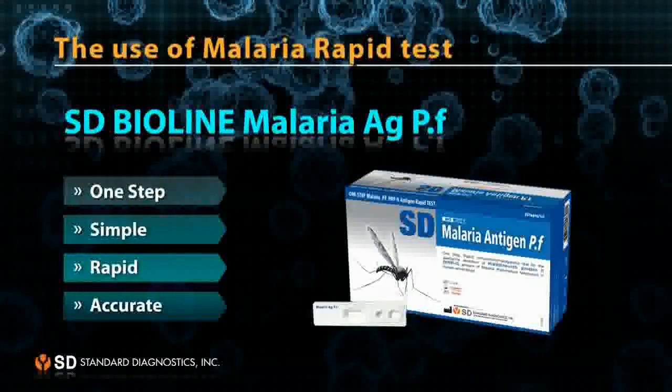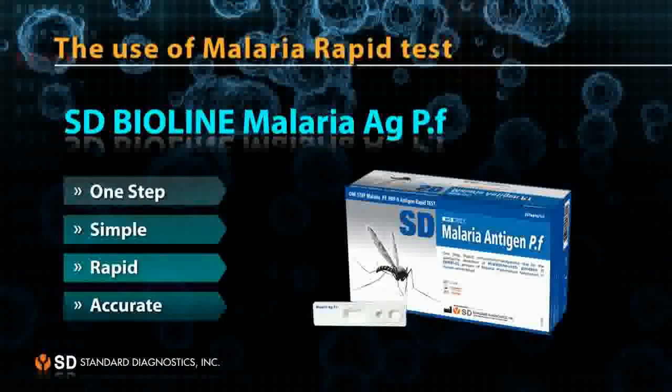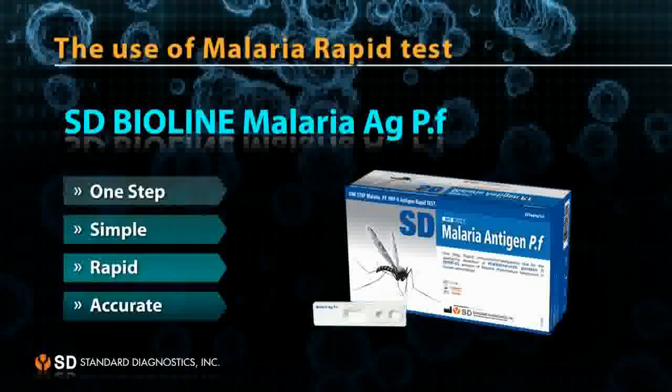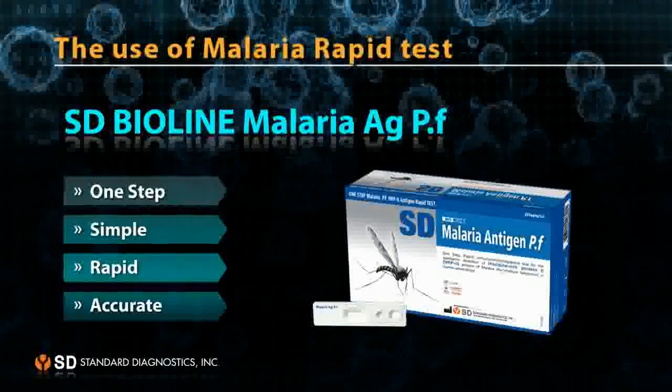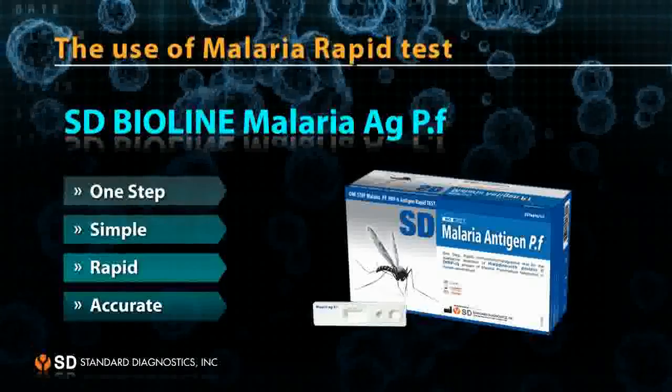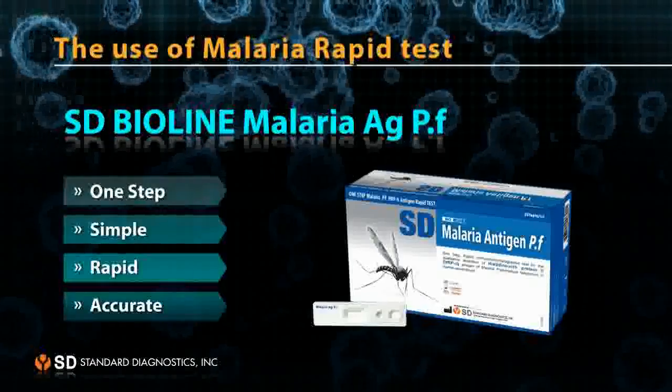Malaria Rapid Diagnostic Tests, RDTs, assist in the diagnosis of malaria by detecting evidence of malaria parasites in human blood. Malaria Antigen PF Rapid Test is a one-step, simple, rapid, and accurate test.